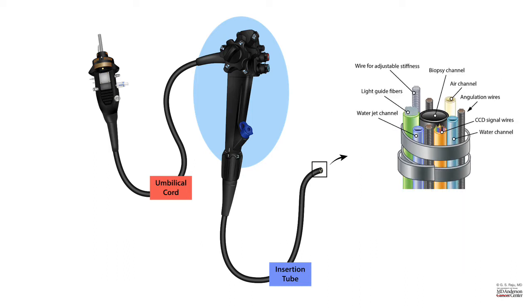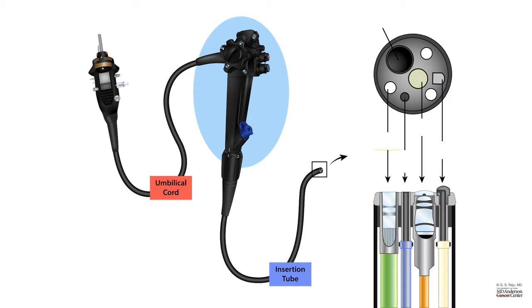In a little more detail, and how do they relate to the tip of the scope. It has air-water channel, suction/biopsy channel, water jet, lens or an objective lens, and a light guide. So let us look at this in a little more detail.